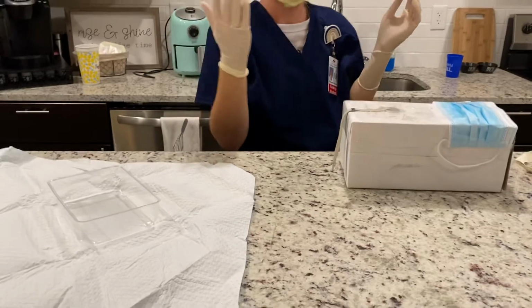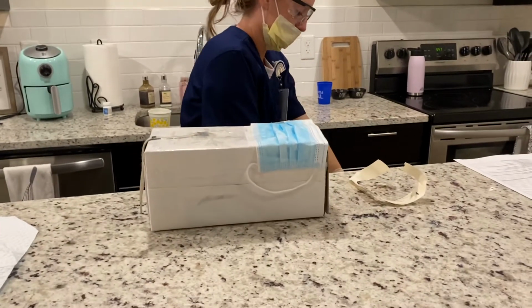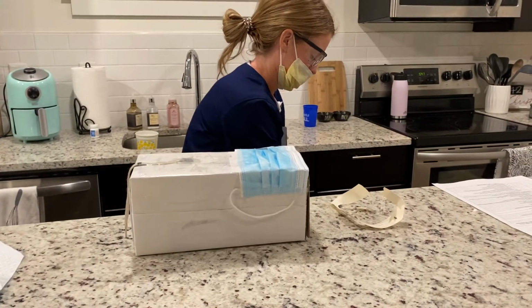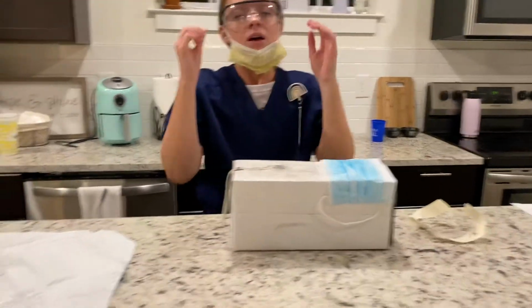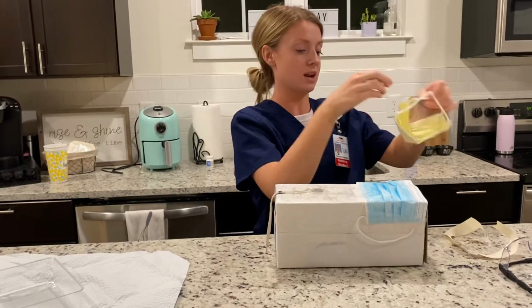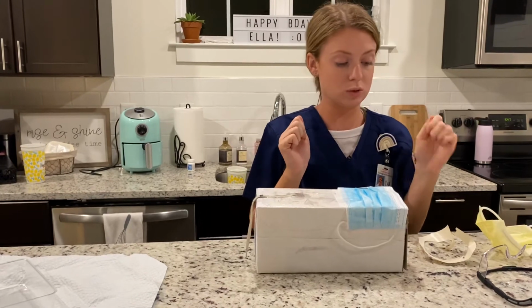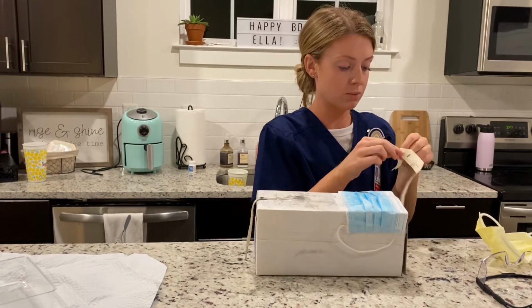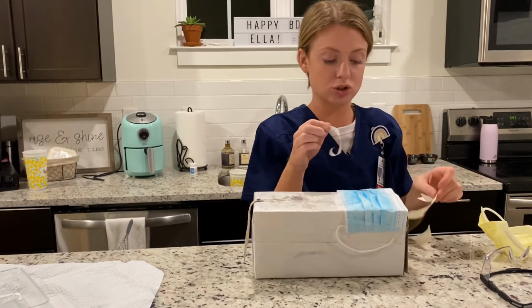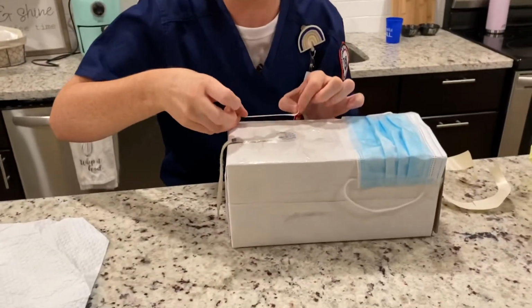And so now I'm ready to dispose of my sterile gloves, glove to glove and skin to skin. I'm going to remove my goggles and my mask, and I'll also remove the patient's mask. And now I am going to apply my label. Now I want to make sure that the date, the time, and my signature are on it, and I want to make sure that it does not cover the insertion site.